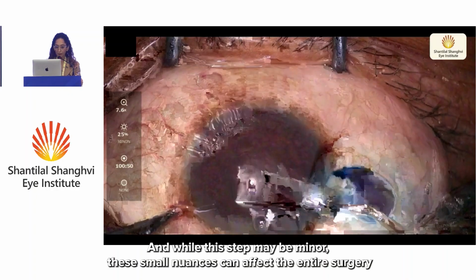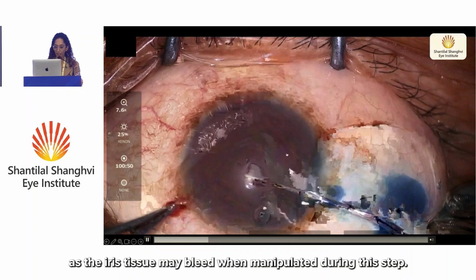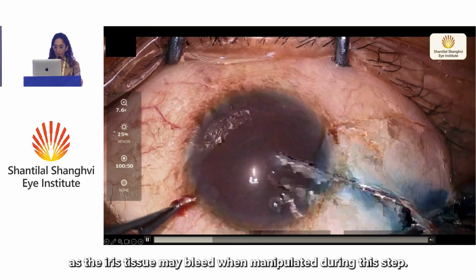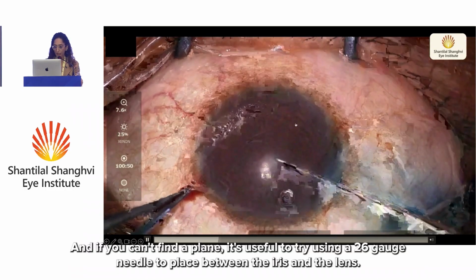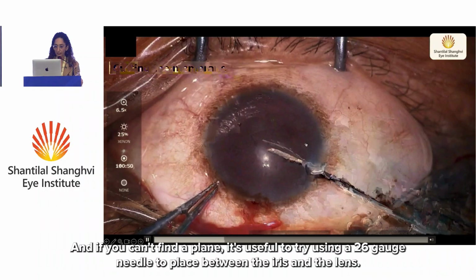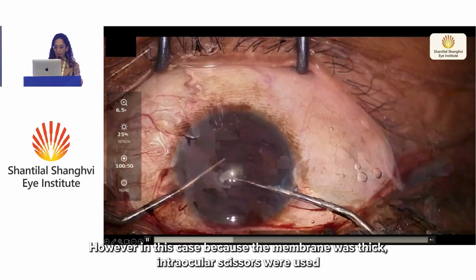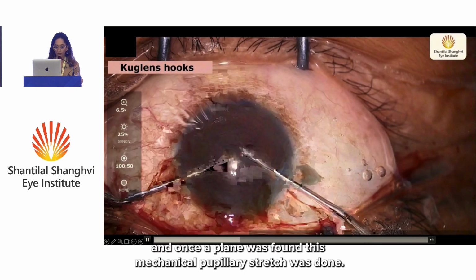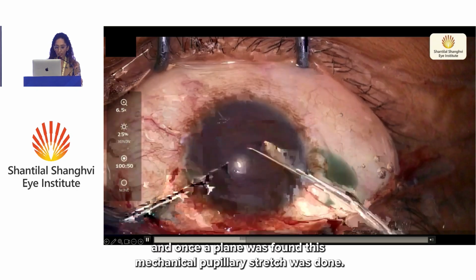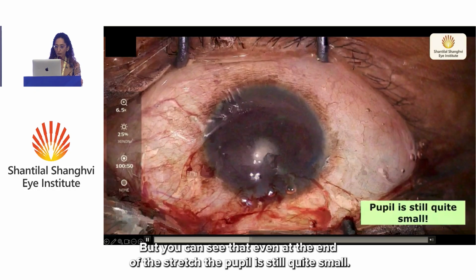While this step may be minor, these small nuances can affect the entire surgery, as the iris tissue may bleed when manipulated during this step. And if you can't find a plane, it's useful to try using a 26 gauge needle to place between the iris and the lens. However, in this case, because the membrane was thick, intraocular scissors were used, and once a plane was found, this mechanical pupillary stretch was done. But you can see that even at the end of the stretch, the pupil is still quite small.